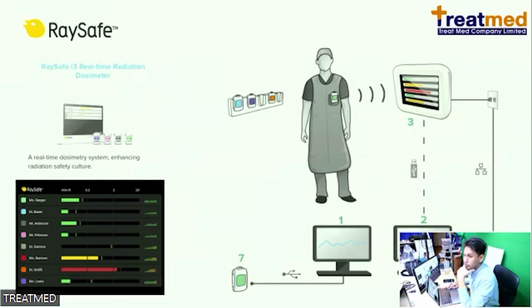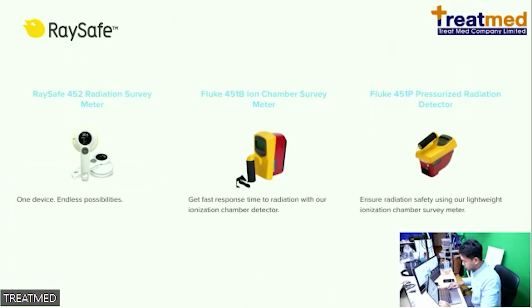This one is the real-time dose monitoring, and we also use it in the cath lab in the hospital, and we can see the dose in real time. And this is for the X-ray survey: when we expose the X-ray, we can use this device to measure the X-ray inside the X-ray room and outside of the room.